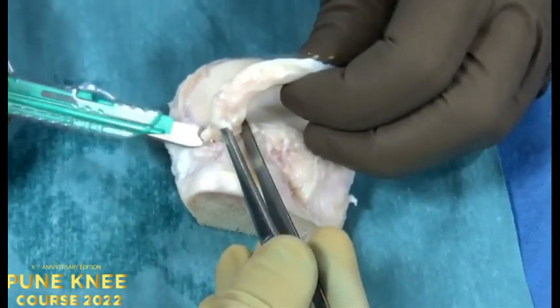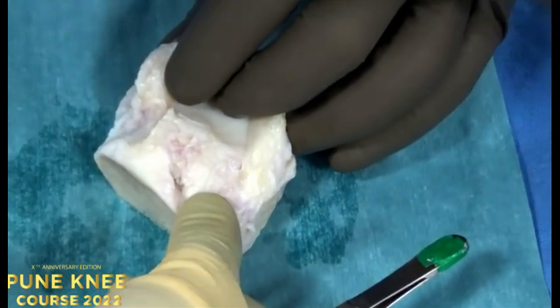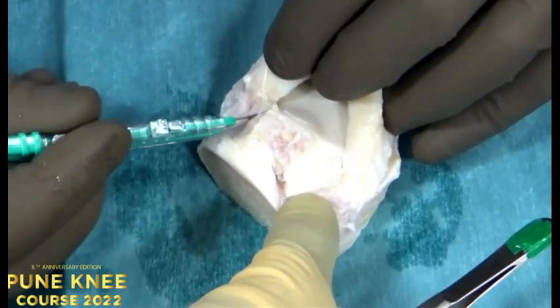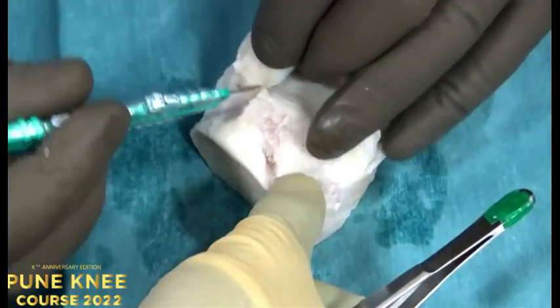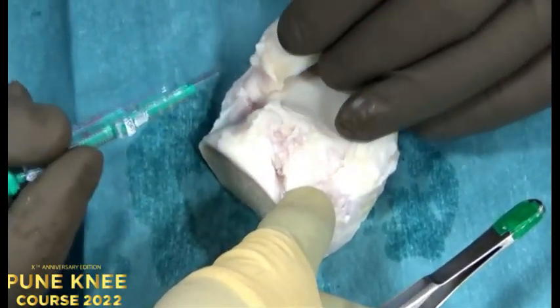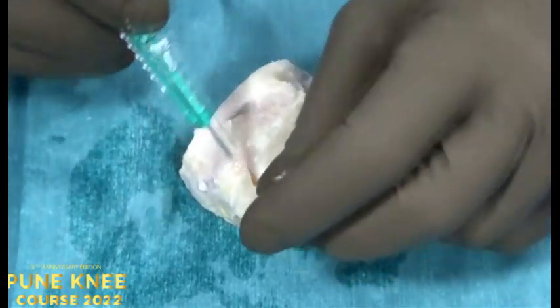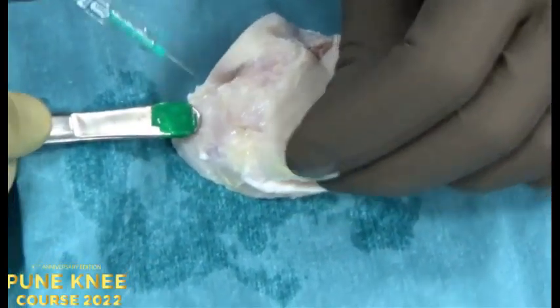So you see here, I'm trying to detach, to resect. The posterior horn is harder because the insertion is smaller, as you are observing here. So you're basically taking it with the white shiny fibers. Exactly. I like to keep that and to perform the whip stitches right in that part. Otherwise, it would be similar to the root repair, which is nothing within the tunnel, only fixation.